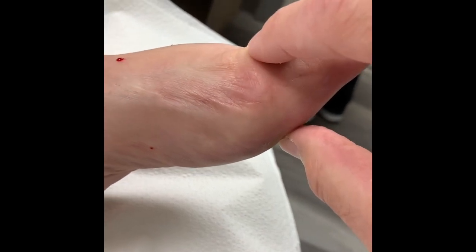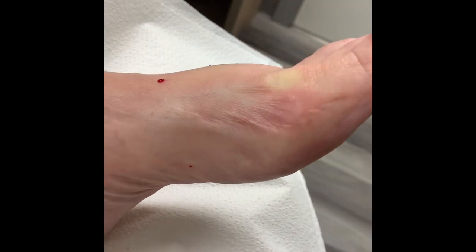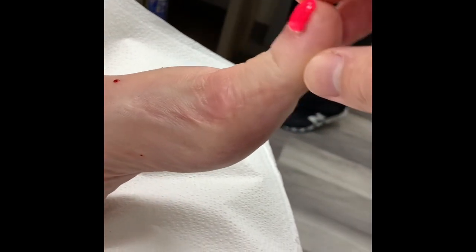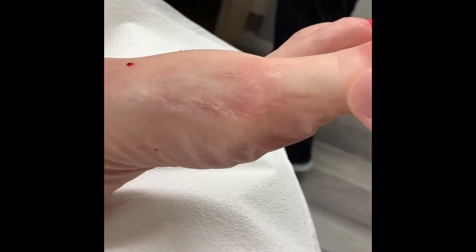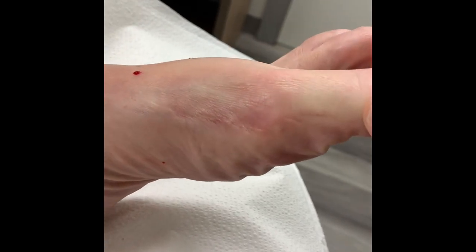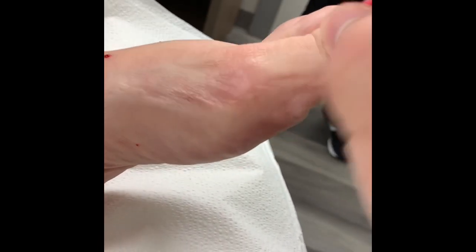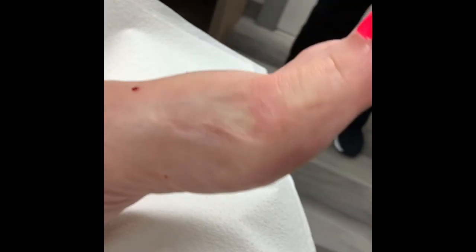The patient had a previous surgery many years ago, but that's not the problem. The problem is that she developed this condition again in the last couple of years — hallux limitus. The nice thing about this patient is she has really great range of motion with no crepitation. Crepitation means when you hear the joint crackling — when there's bone-on-bone. There is none of that, so her range of motion is really nice. We're going to shave down some of this on the other side.